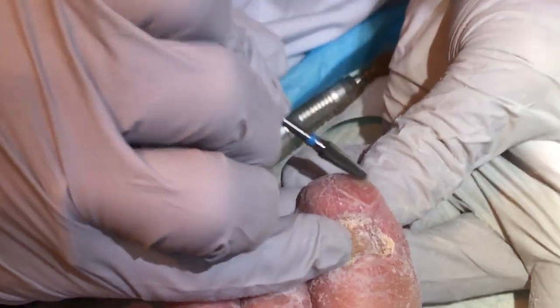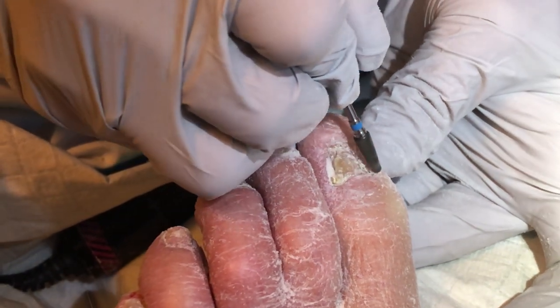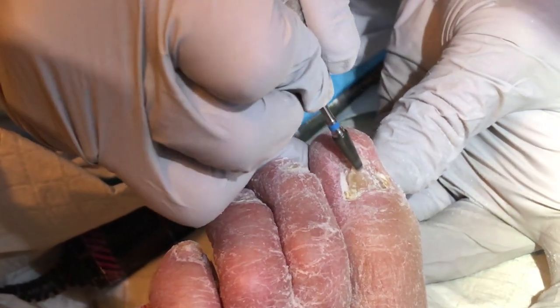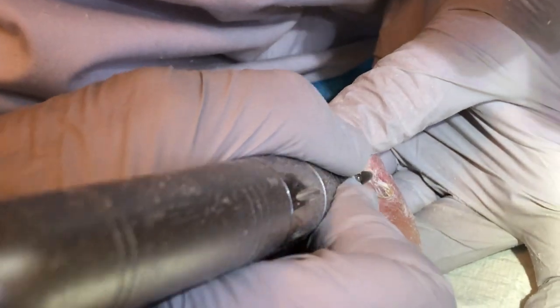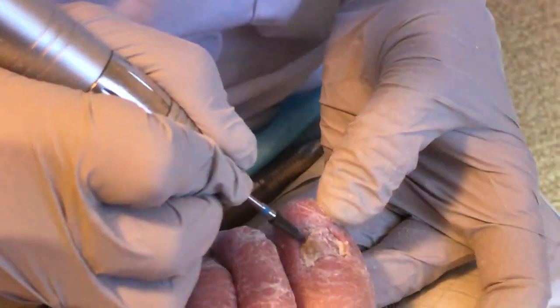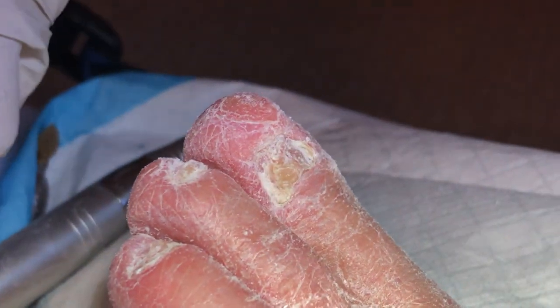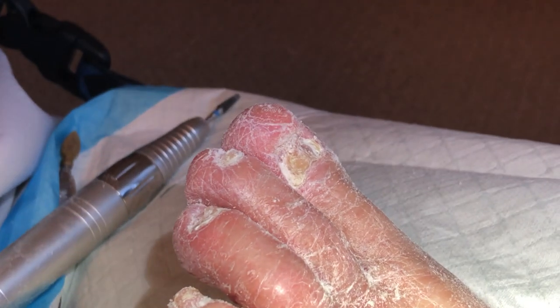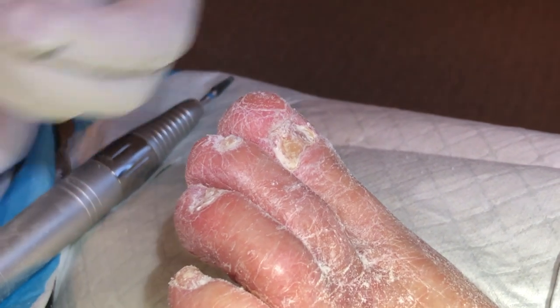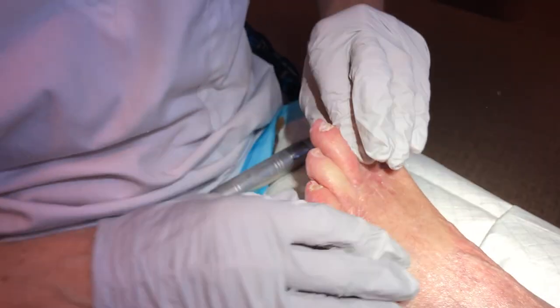He's got a little callus up here. Can I take a side view of that big one when you're done? Yeah. That's much better. Yeah, okay — and this whole thing is amazing.